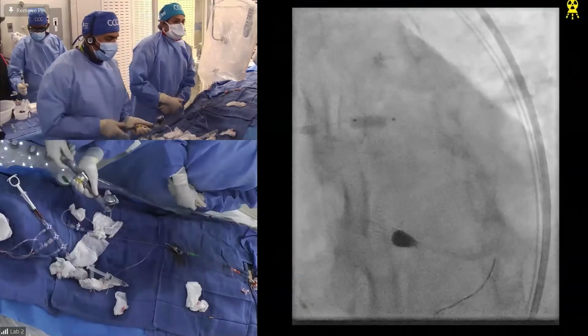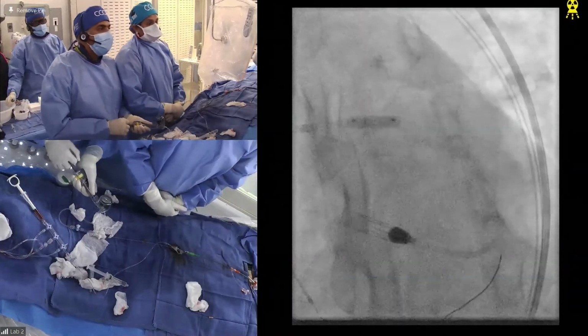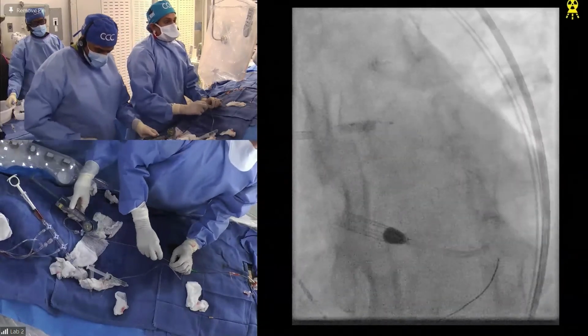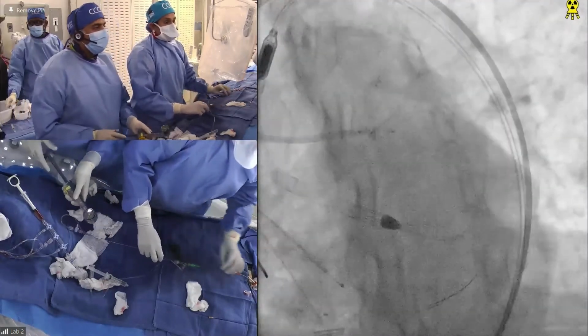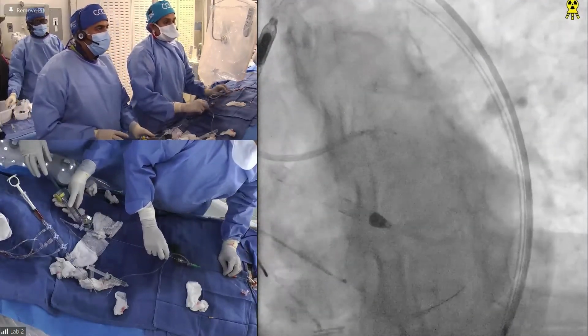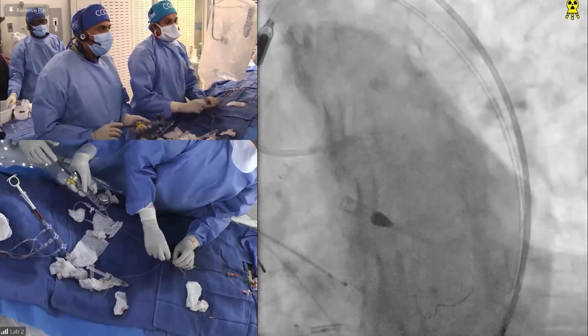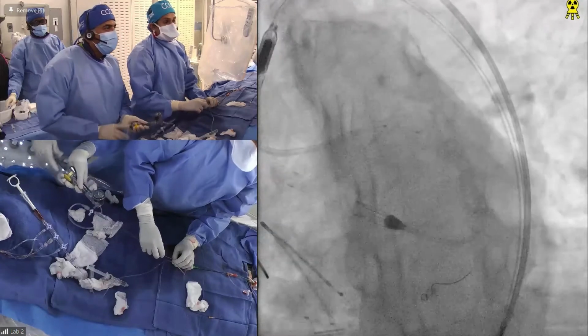Yeah, I think you can use this balloon and dilate a little bit down into that distal stent too. Overlap with it. Yes, I still think you have to do that, whatever you put in the proximal portion of that, whatever other stent you put in the prox circ, put in the LPL. Those are the same. Okay, we now have 2 minutes. Prox circ, LPL, exact same.